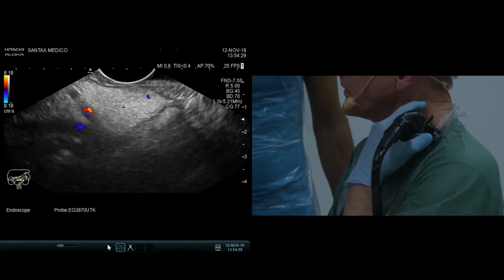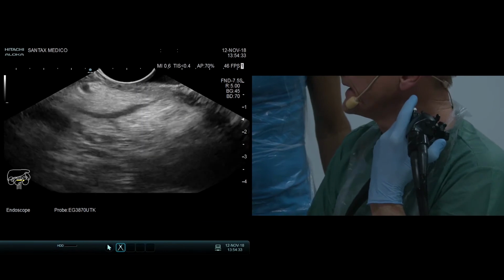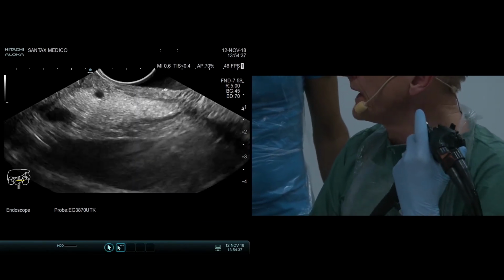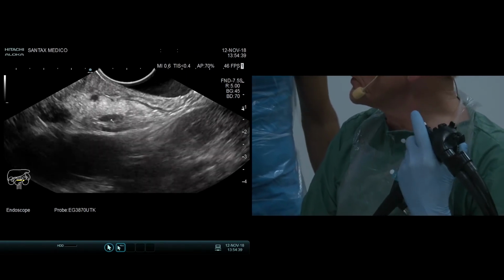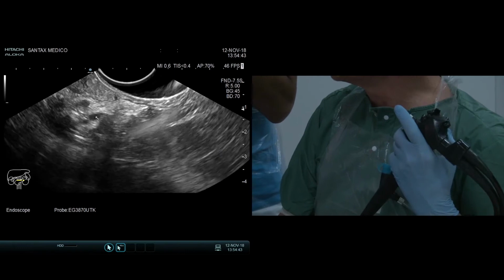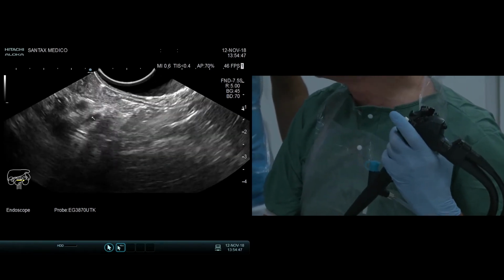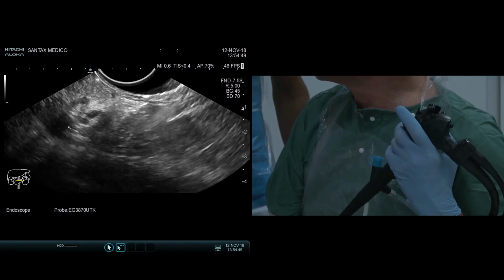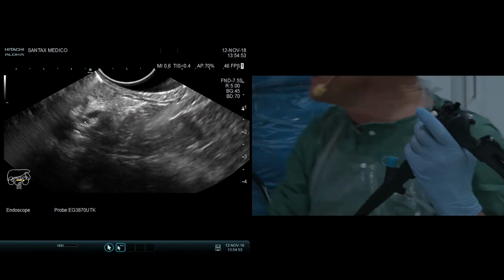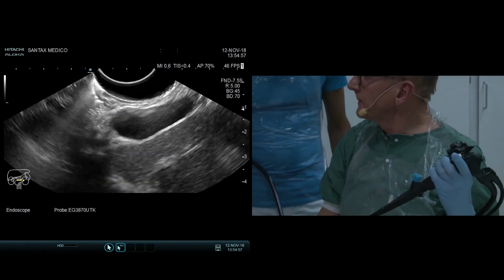And the head of the pancreas that we see here, if we follow the CBD upwards, and at a point we need to turn, and you see here the CBD in a transverse scan, and I think it's the cystic duct that is merging with the CBD here. Portal vein. No, yeah, portal vein and the cystic duct here. And the gallbladder is coming.